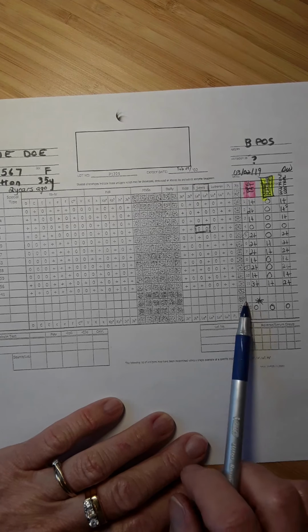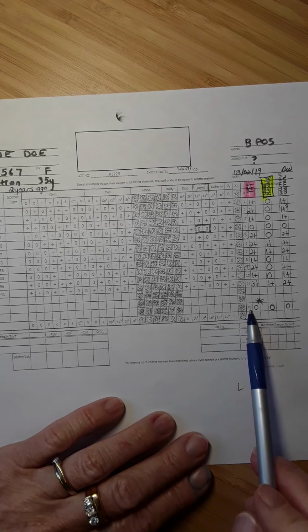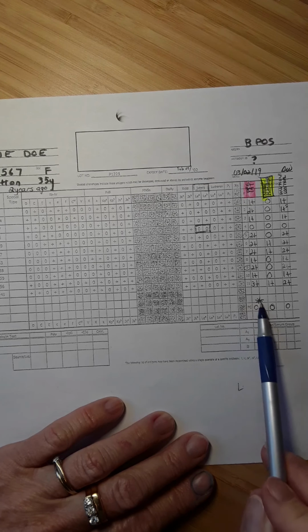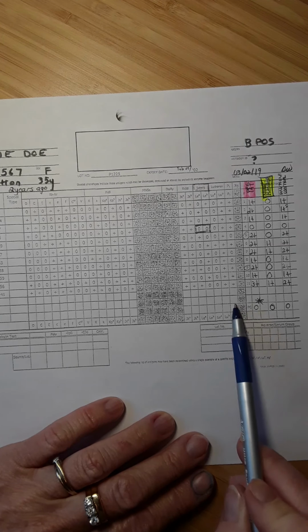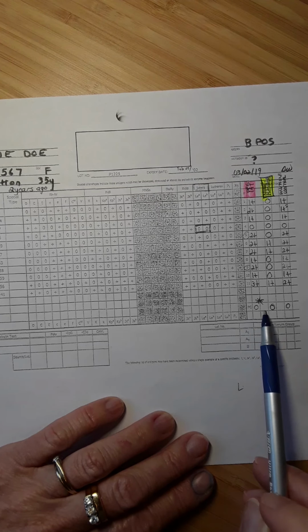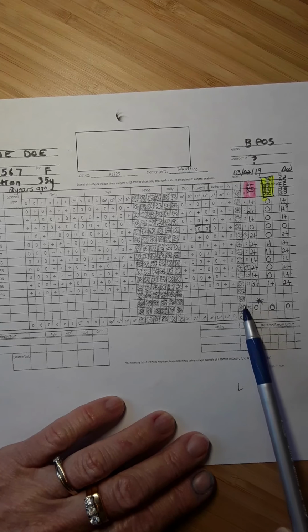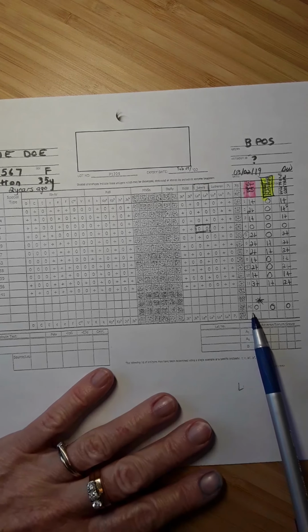This last tube, you don't really have to know too much about it right now, but that is an auto control. So in this test tube is patient's plasma and patient's own cells, plus PEG, taken through IAT. If that was positive, we would be concerned that the patient has an autoantibody. And what we would do next would be a DAT to see what is coating the cells. But when we look at a panel, one of the first things we look for is that auto control. Oh, it's negative. Great. This isn't an autoantibody.